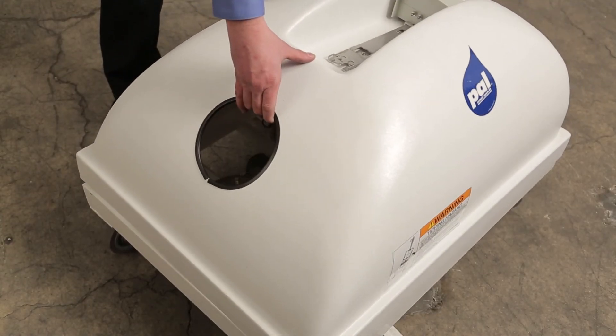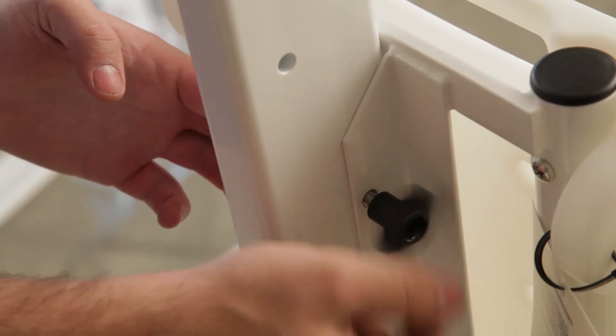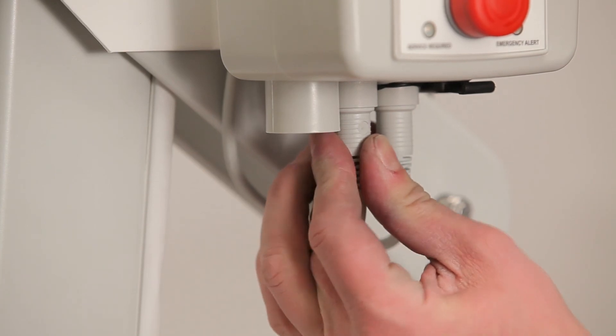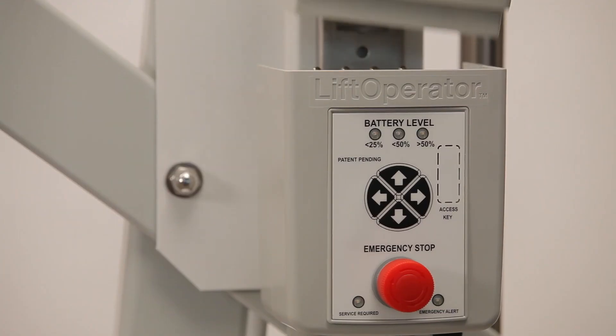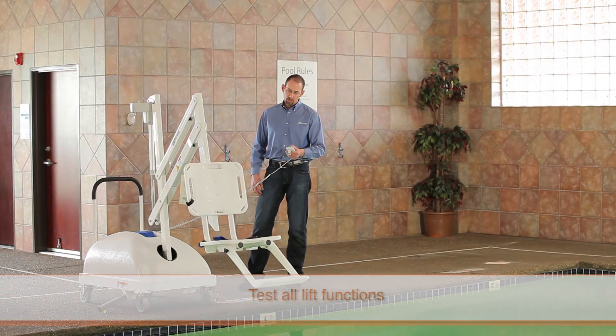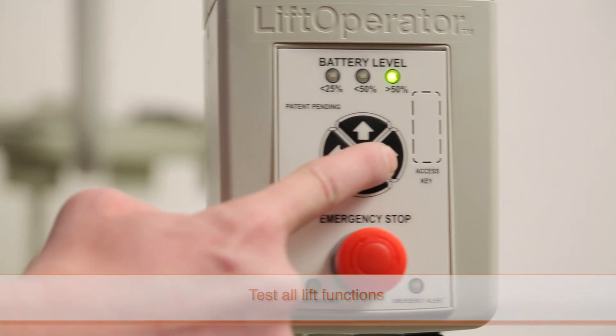Confirm you have installed all replacement parts and reassembled all motor and gear components properly. Then replace the cover on the lift, replace the mast assembly, reattach the seat assembly, and reconnect all of the cables to the control box, making sure they are plugged in securely, then reinstall the battery.